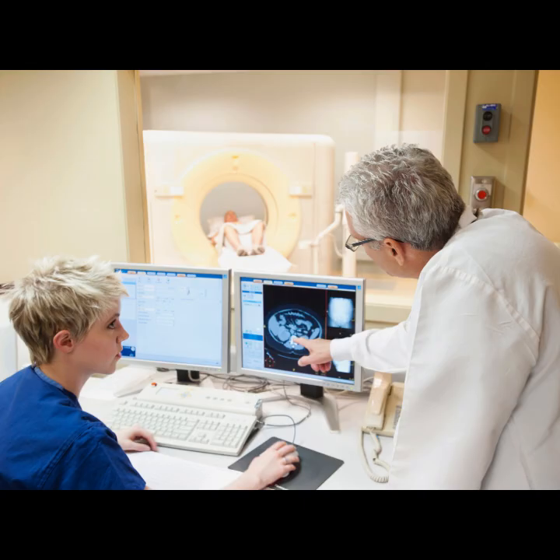Okay, let's talk about that rigidity, though, specifically in the context of acceleration. Because when clinicians push for faster scans, they inherently have to undersample the K-space grid. Now, when you undersample a fixed Cartesian grid, you introduce pretty severe structural artifacts and aliasing, and that requires massive post-processing fixes, things like parallel imaging or compressed sensing, just to compensate. That seems like complexity born out of necessity, not really by design. I would argue, though, that those fixes are well-vetted, established clinical tools.